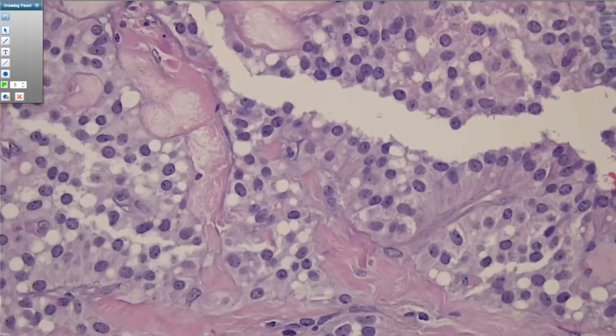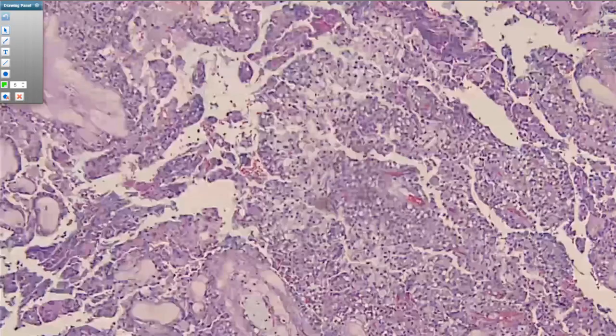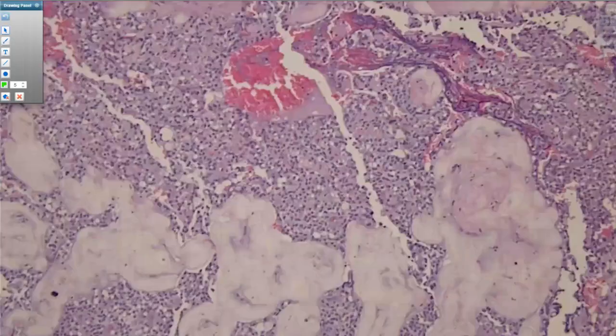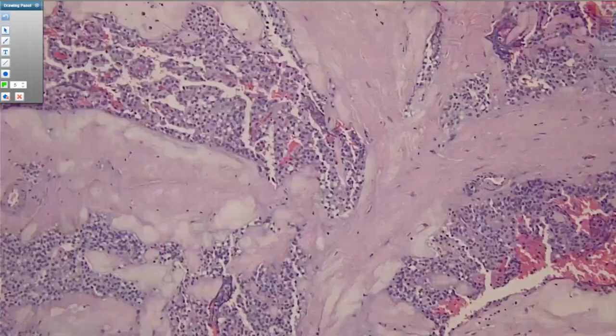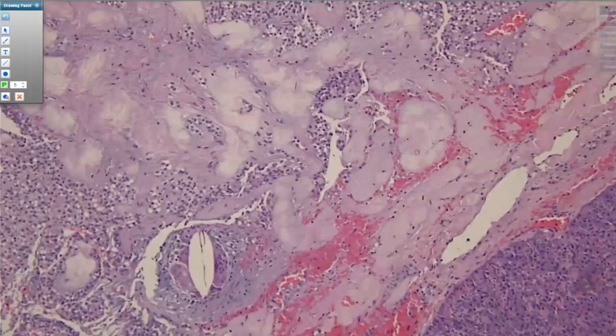If you're lucky, you find some beautiful round pink hyaline globules. And these degenerative changes are very characteristic, seeing these big areas of foamy macrophages, cholesterol clefts. All of those really help clue you in that this is a solid pseudopapillary neoplasm. Here again are beautiful cholesterol clefts.